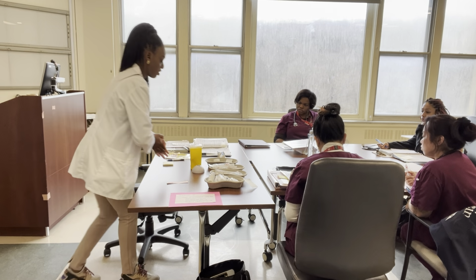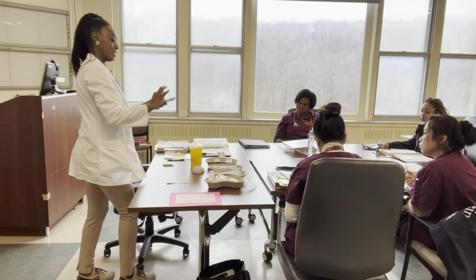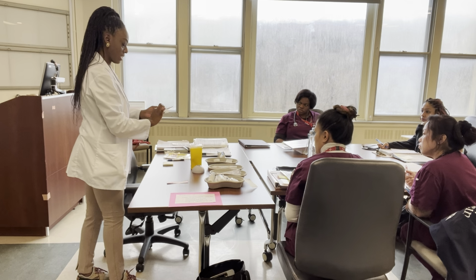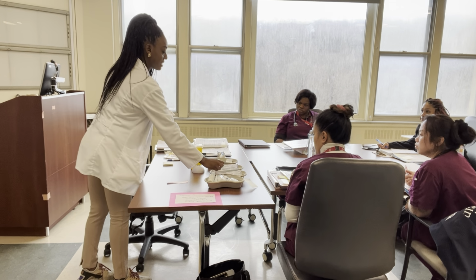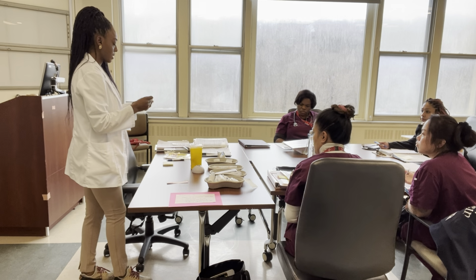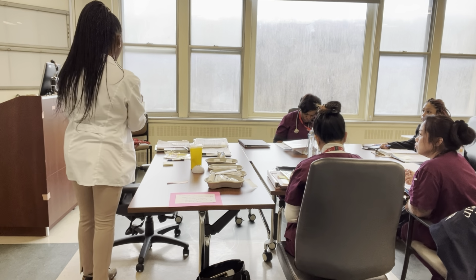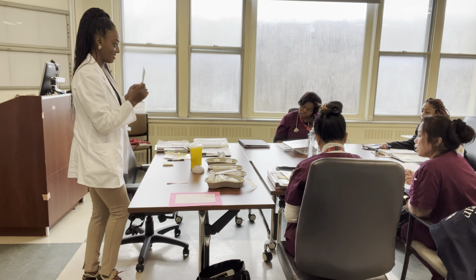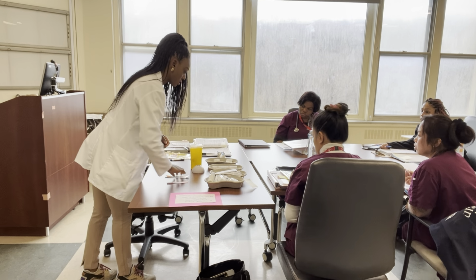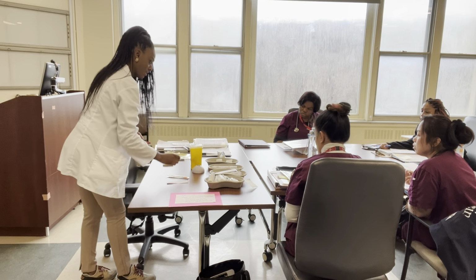Good. So I'm going to pick the right syringe. There's 2 here. I need to read them to make sure what the syringe says. This is not the one I want, for example. How do I know? What type of syringe am I looking for? Good. So this one says insulin syringe, and I look to see when it expires, 2029. Are we good to use it? Yes. Okay, so I'll take this syringe, and it comes with a needle. You told me I needed alcohol, I heard you say.